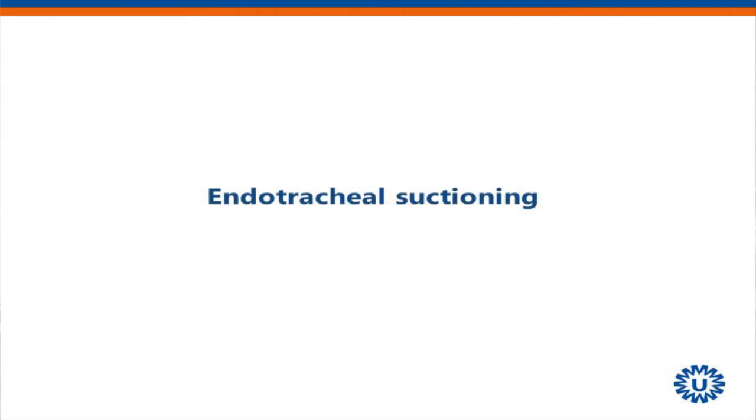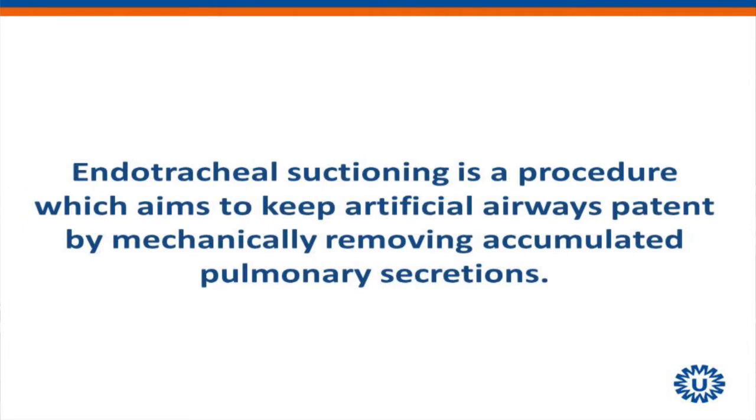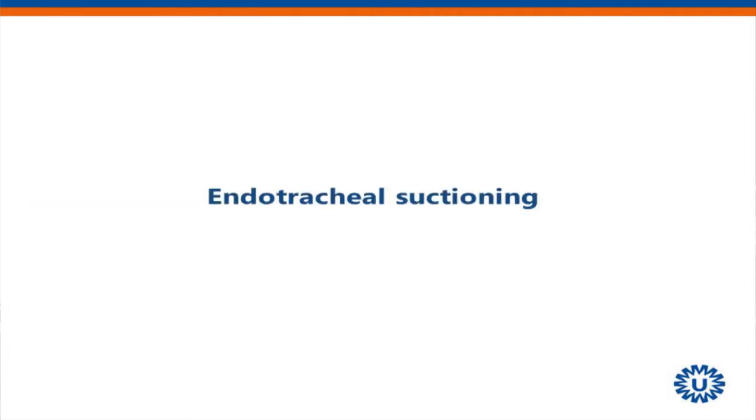What kind of endotracheal suction do you use? Are you suctioning with an open system or with a closed system? Closed. Closed. Closed. Nobody open? No. No? Why not? Why do you use a closed system? I think it's okay. I think it's good. And your pediatric intensive care, what do they use? No, neonatal intensive care unit, and we use the system from the devices from Kimberly. Okay, that's what you see lying there.